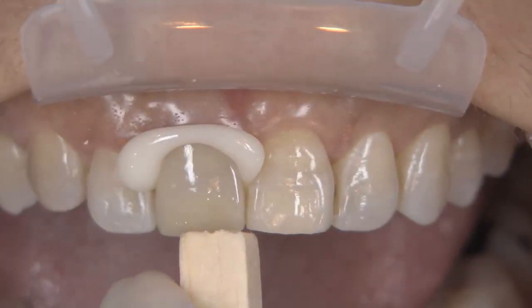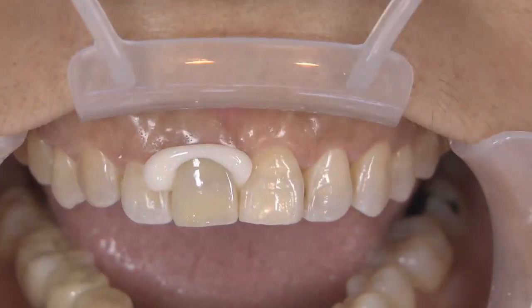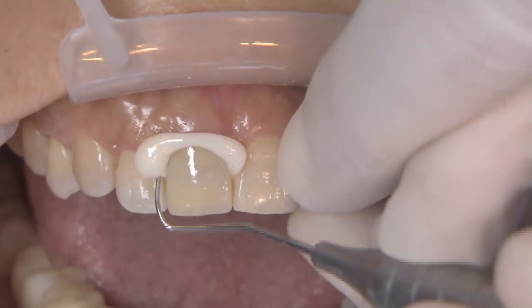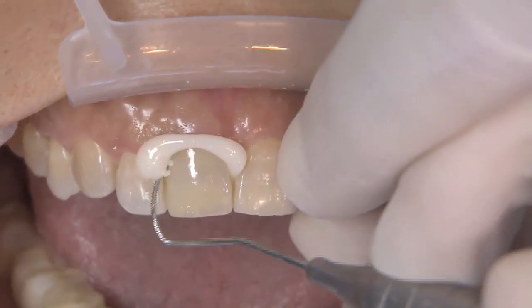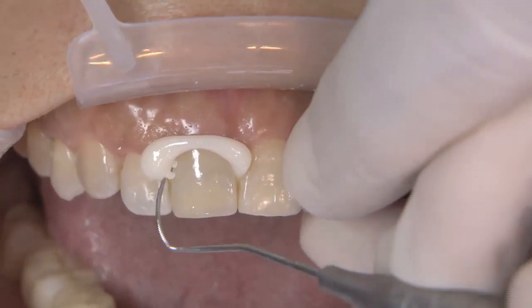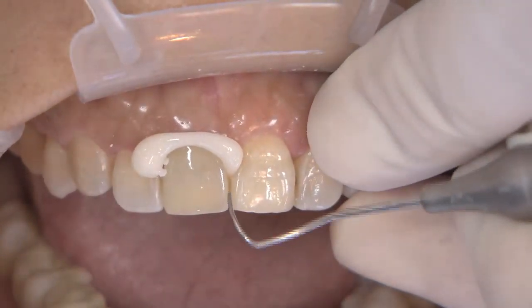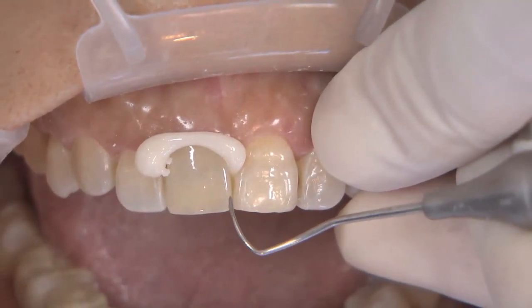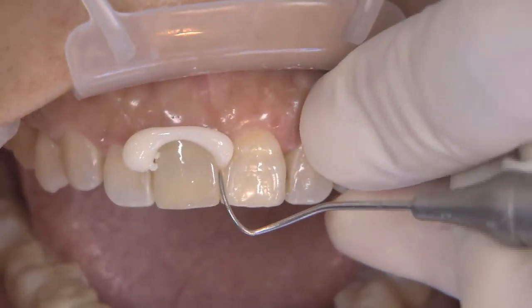One of the neat things about the Nexus RMGI is the light activation. You'll see me hit it and I'll test it with an explorer, and then hit it again for just a second. I'm just trying to get it to its gel state. Because one of the unique properties of Nexus RMGI is your ability to take it off basically in one piece — kind of a one-peel approach that I like to take.